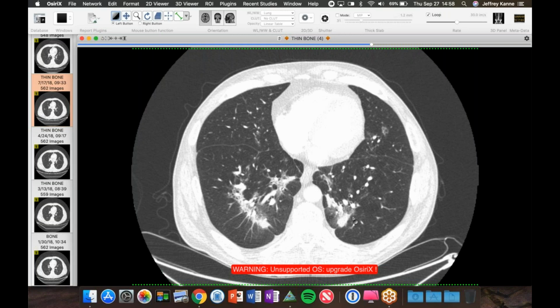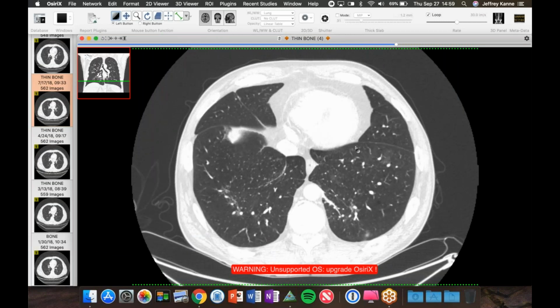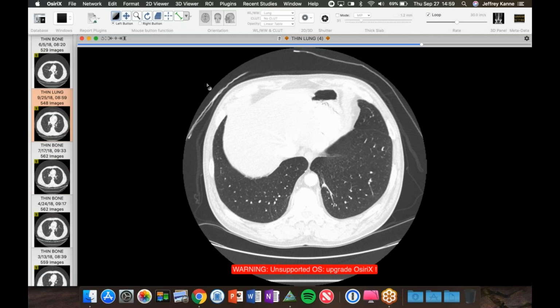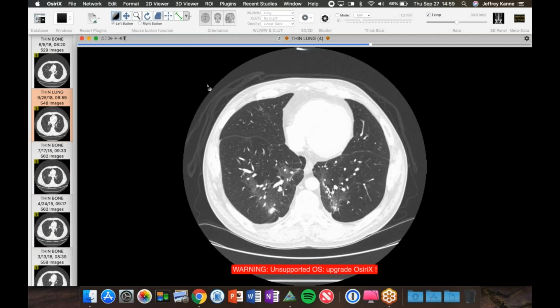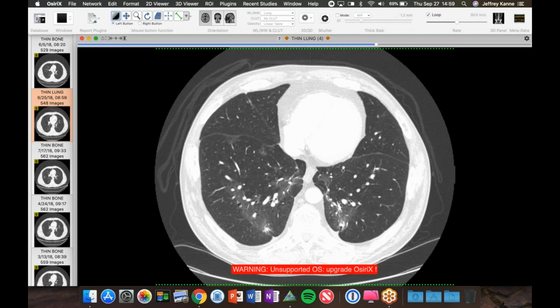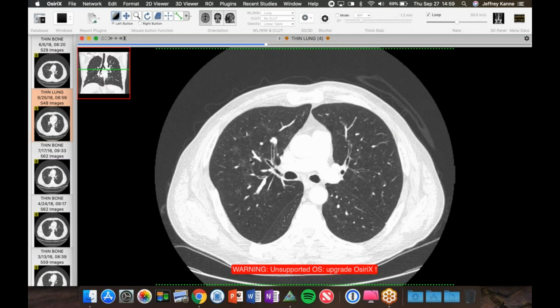The organization is moving more laterally. So now we're getting really outside the treatment area because usually it's a PA, maybe some angled beam to avoid the esophagus, but it's not a typical SBRT type pattern. And it's got these nice sort of atoll looking picture and some findings more peripheral. And it just continues along. Here's another one. This was the most recent one. And you can see at this point, it starts to melt away as it moves more laterally, but the consolidation melts away. But the stuff in the right upper lobe also seems to melt away.